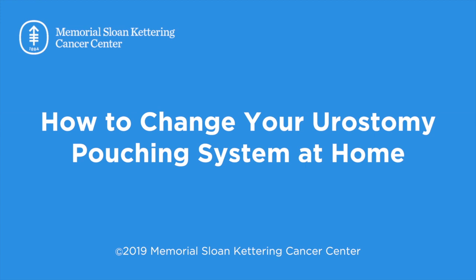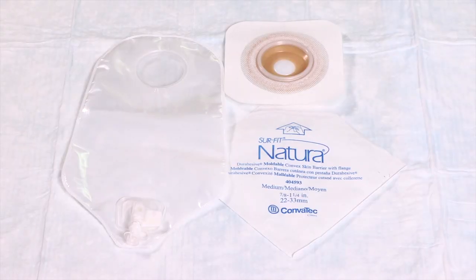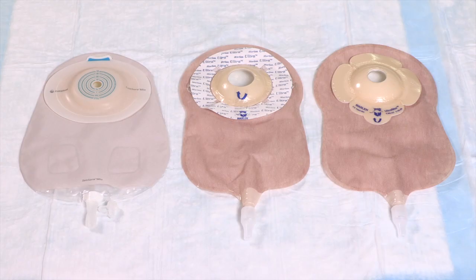This video will show you how to change your urostomy pouching system at home. Your pouching system includes a wafer, which is the part that sticks to your skin, and a pouch that holds your urine. You may be using either a two-piece system, where the wafer and pouch are separate, or a one-piece system, where the wafer and pouch are attached.